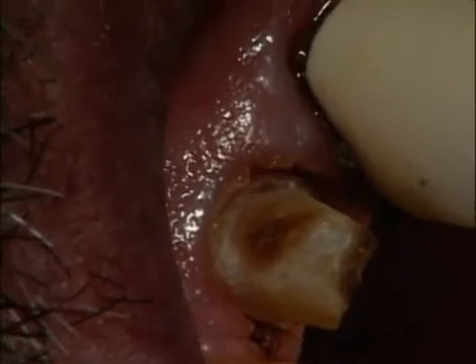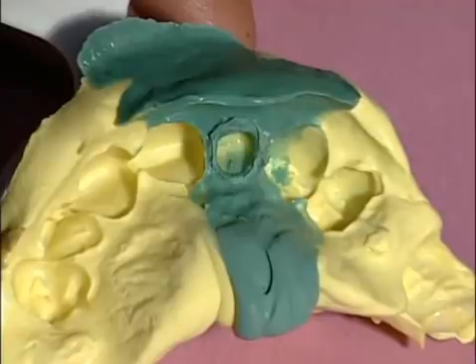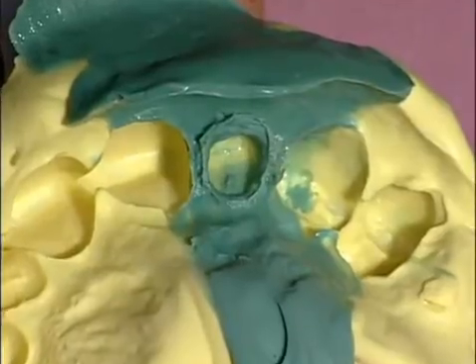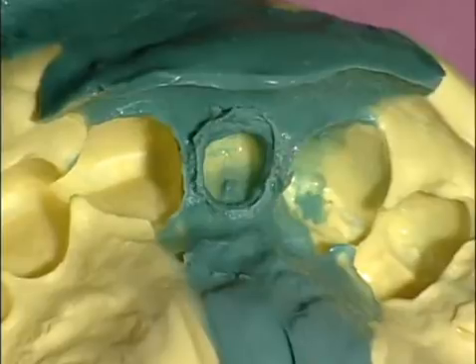Here's our impression. You can see we have perfect margins. Our laboratory just loves our crown preps. We don't pack cord. We trough around every crown prep to get an excellent impression every time.